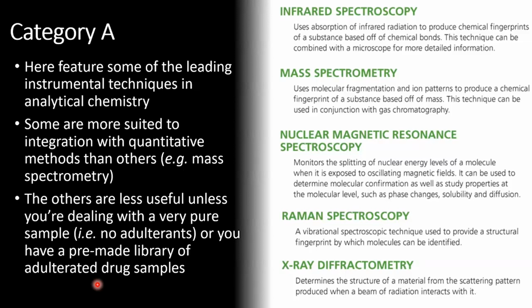So samples with no adulterants, they haven't been cut with any other cutting agents. You could theoretically use some of these other methods to analyze mixtures, but then you would need a library of mixtures with known compositions. And practically, that's just not particularly feasible.